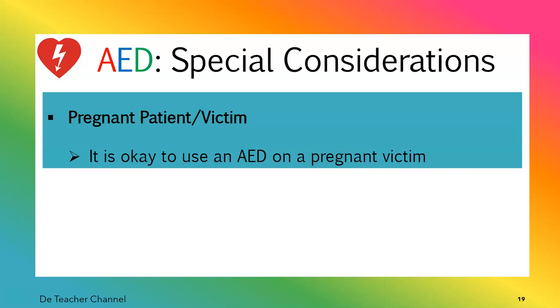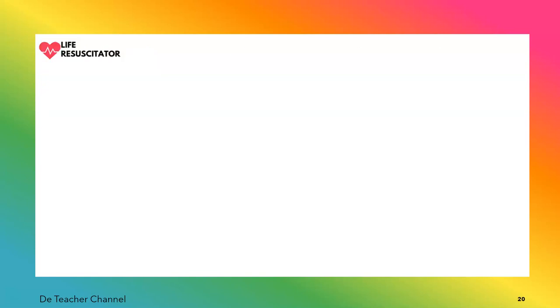There's no problem. Alright, so I believe you have learned a lot: how to use an AED, what to use an AED to accomplish, and when to use an AED. So I believe you can now operate an AED.